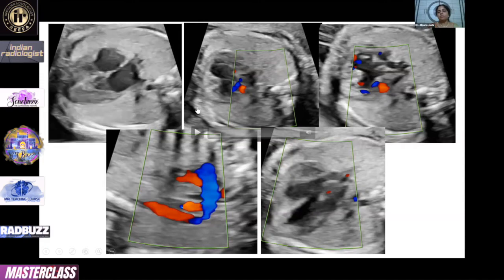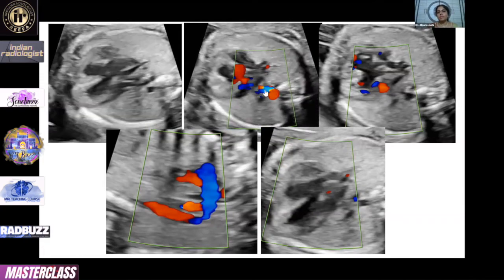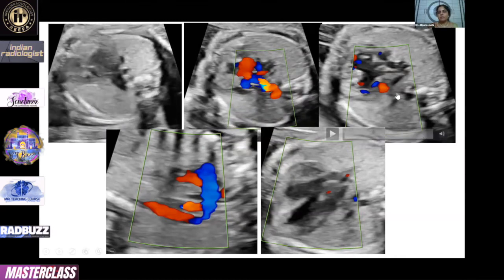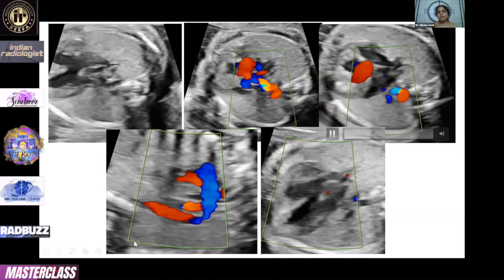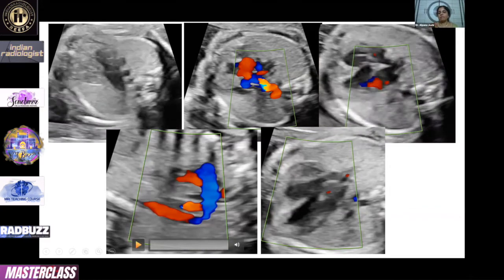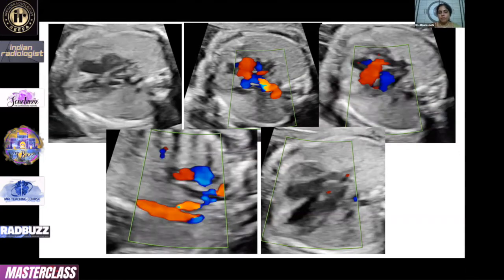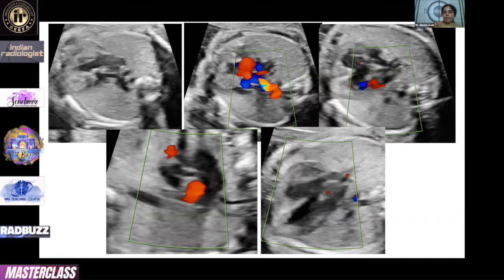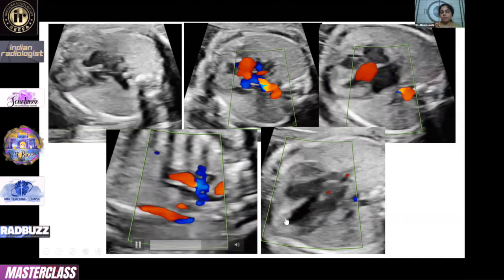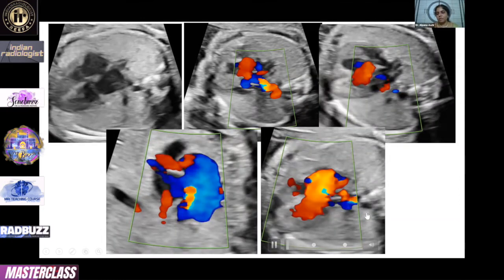And then when the color Doppler is put on, you are seeing a sort of aliasing there. Normally you don't see any vessel here. And then when you are thinking in terms of PAVSD, of course, again, that will be covered extensively with the topics of CHD. But again, it is a right heart problem. So these are the typical MAPCAs, what you are seeing.